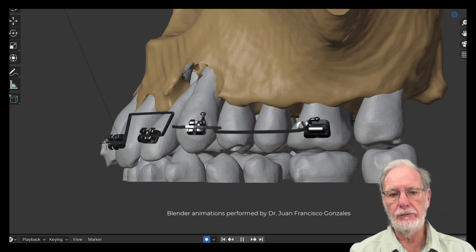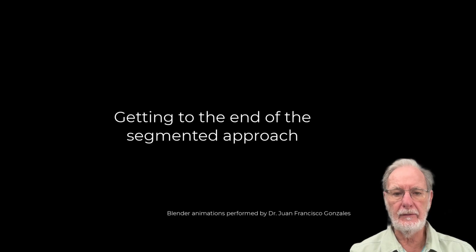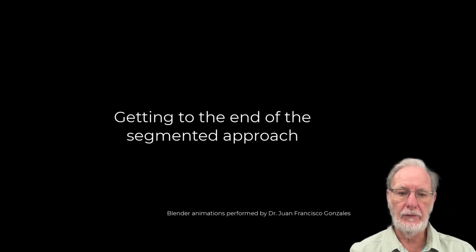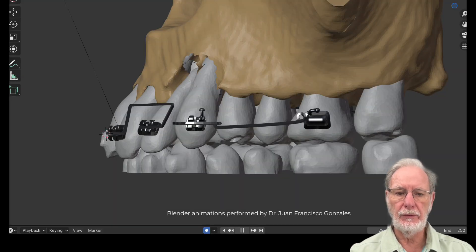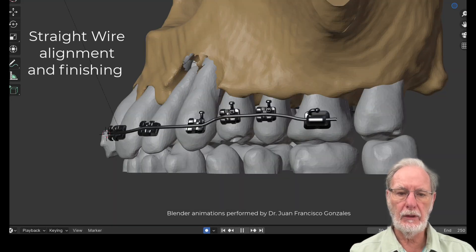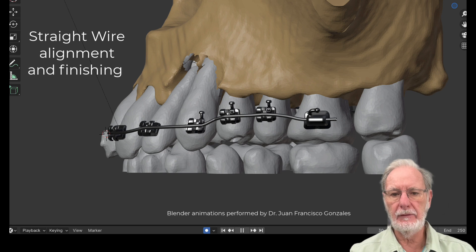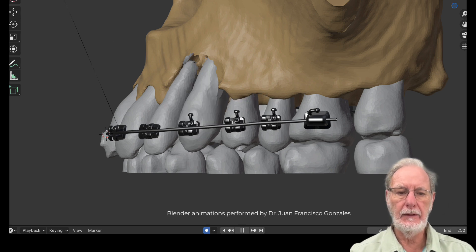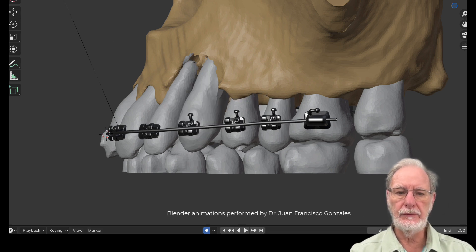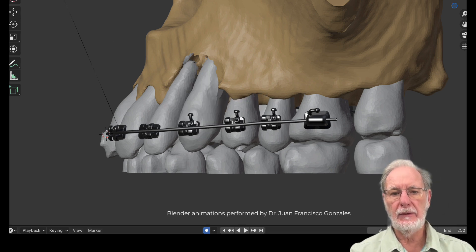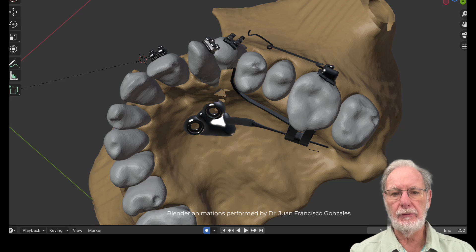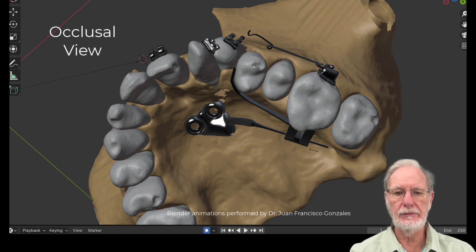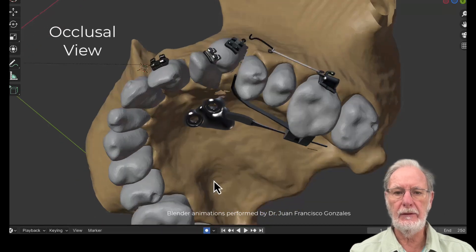We then move on from segmented to straight wire. We align the teeth with nickel titanium, and from the occlusal view you can see that the same movement occurs. It's all self-limiting.